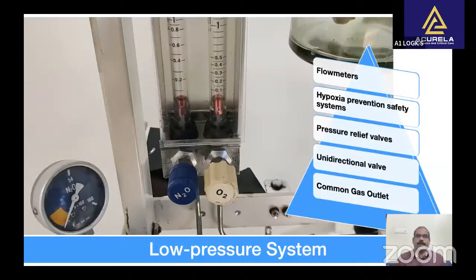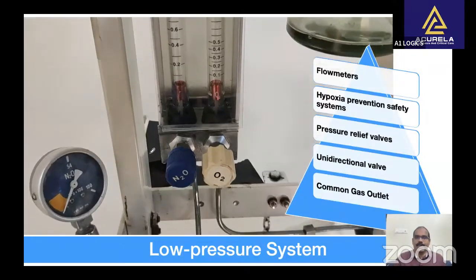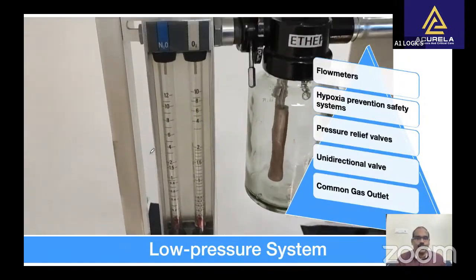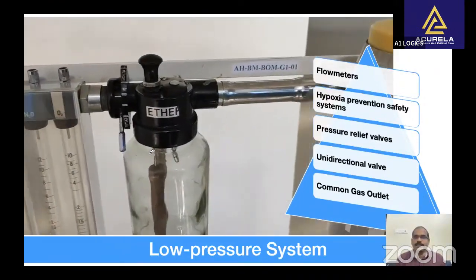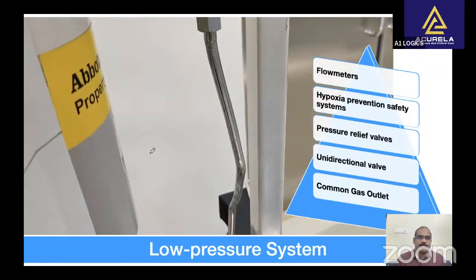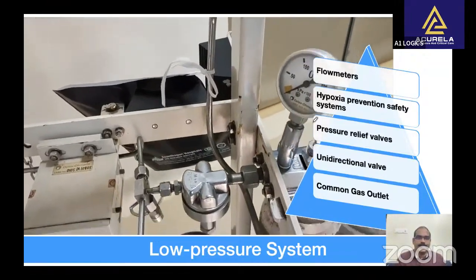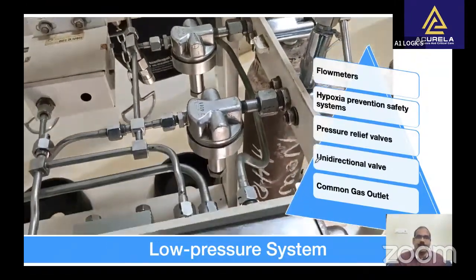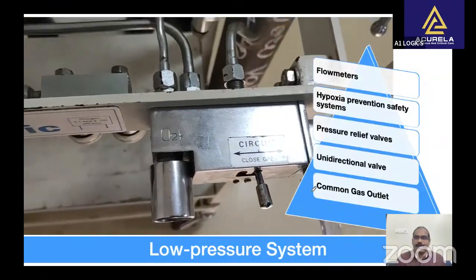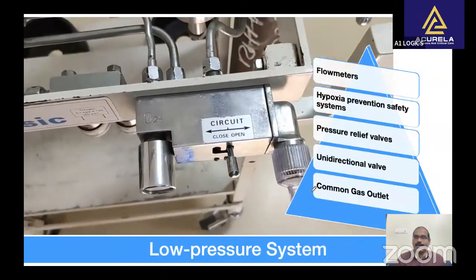Now we come to the third part, the low pressure system. Low pressure system is downstream of the flow control devices. The pressure in this section is only slightly above the atmospheric and variable depending on the flow from the flow control valves. The components found in this section, that is low pressure system, include the flow meters, some hypoxia prevention safety systems, the pressure relief valves, the unidirectional valve and then the common gas outlet. As you have seen, the vaporizers and their mounting devices are found in the low pressure system.